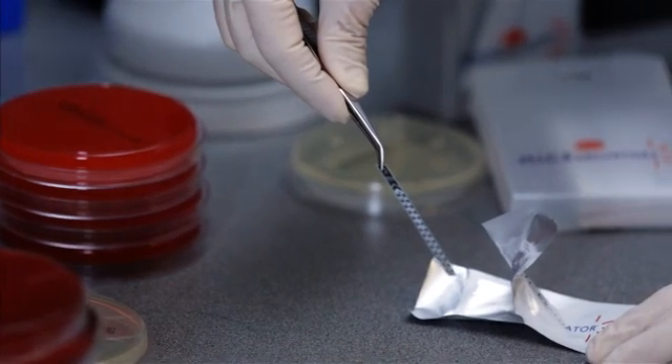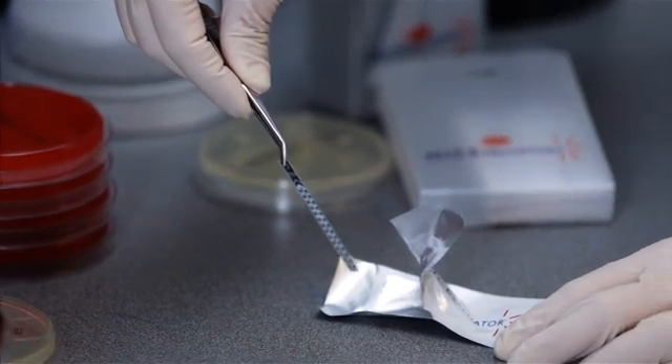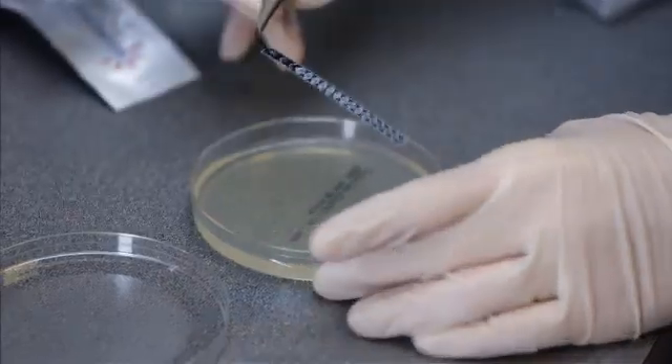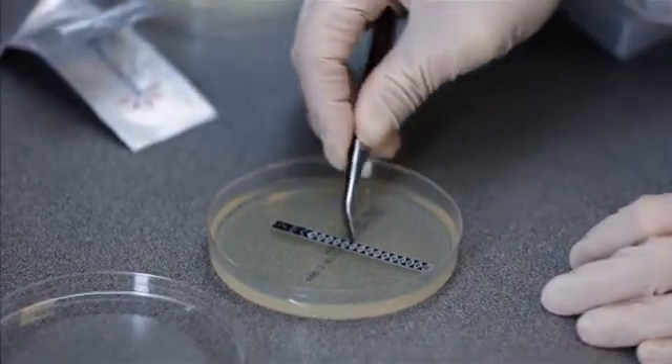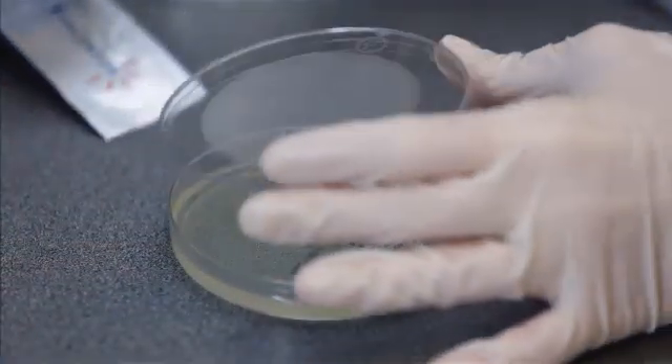Place the end of the strip with the lowest concentration of antibiotic onto the agar first. Then gently place it onto the surface by either rolling or lowering the strip, taking care not to move the strip, as antibiotic will be released into the agar immediately.